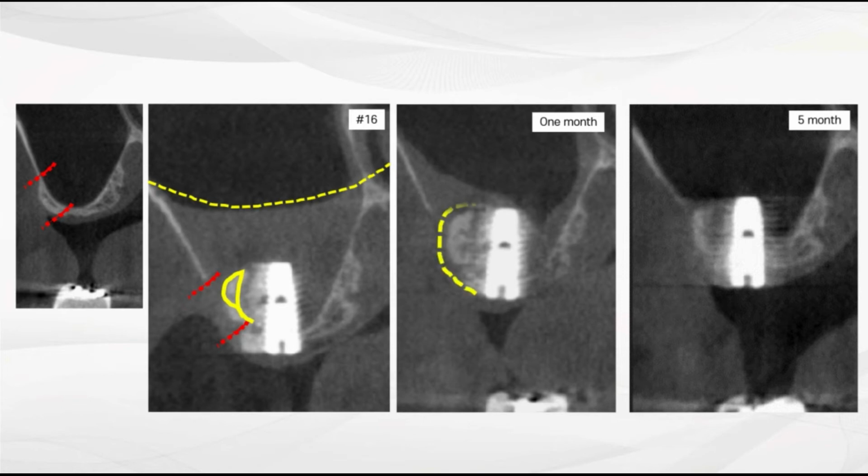One month later, the cortical bone plate and Moldable AutoBT dentin powder kept their position in situ, and the blood level was going down to the implant apex level. That seems to be obtained through the gap in the window opening. Five months later, blood disappeared and seemed to form a new sinus membrane over the implant and Moldable AutoBT. The lateral cortical plate is fused on the Moldable AutoBT and goes through active bone formation and remodeling.